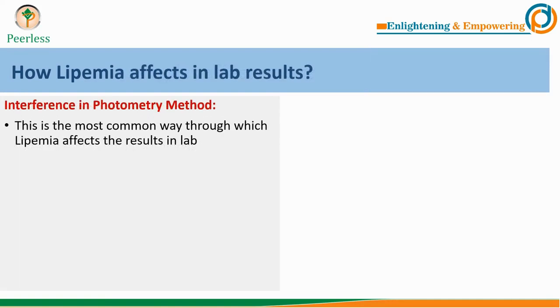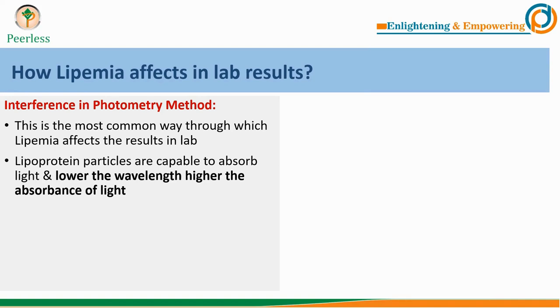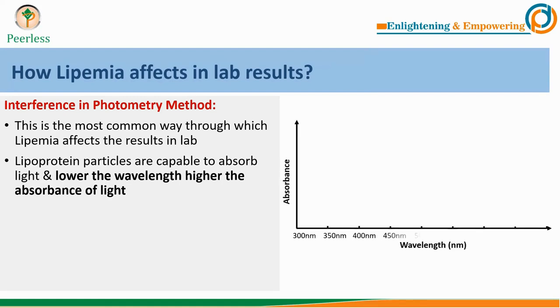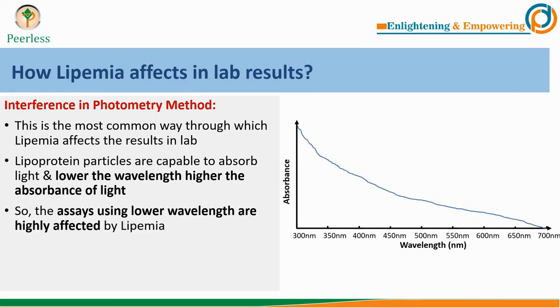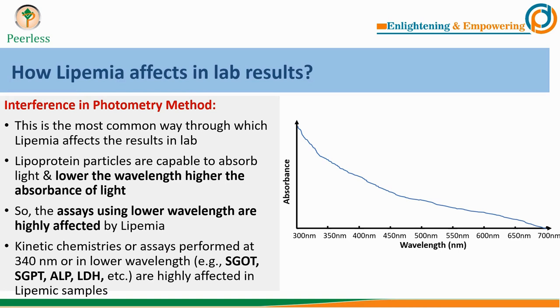Secondly, lipemic samples cause high interference in photometry methods — this is the most common way lipemic samples affect lab results. Lipoprotein particles can absorb light, and interestingly, the lower the wavelength used for the test, the higher the absorbance. Assays using lower wavelengths are highly affected by lipemic samples. All kinetic assays at 340 nanometers or lower wavelength, such as SGOT and SGPT, will give incorrect results if the sample is highly lipemic.